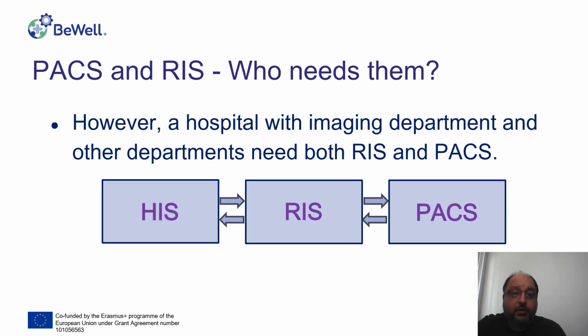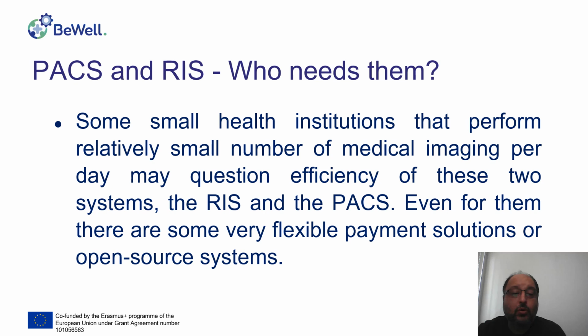However, hospitals with imaging departments, of course, need both PACS and RIS, and they might be integrated in the same module, or have the radiology information system and the hospital information system as different modules, but they need all of these systems. Some small health institutions that perform a relatively small number of medical images may question the efficiency of these two systems.